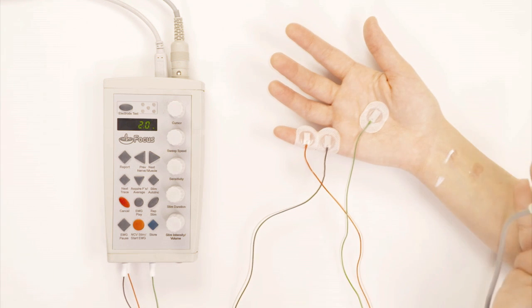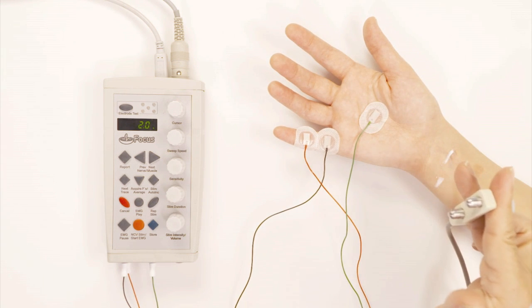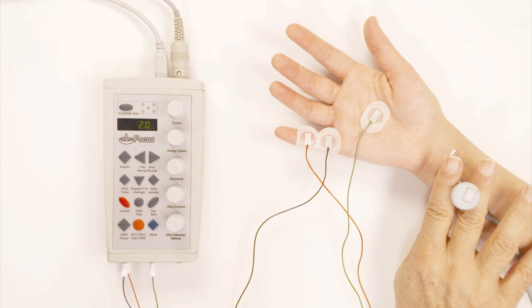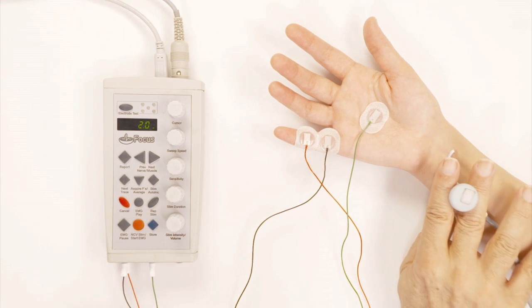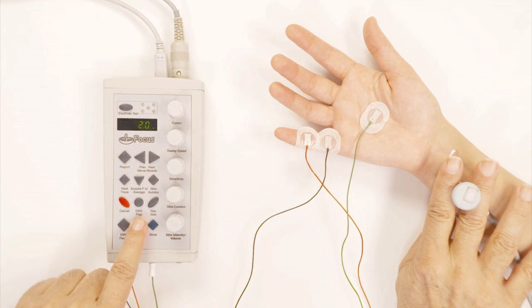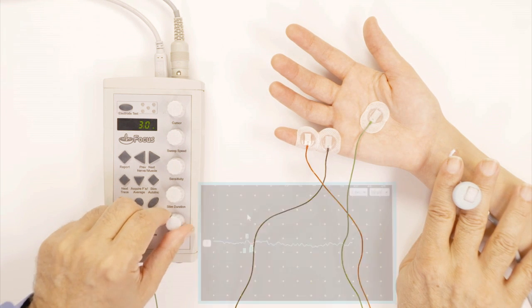I put some cream on the stimulator to make sure I have good electrical conductance. Then I put the electrode right here, that's where the ulnar nerve is at the wrist, and I'm going to begin stimulating. So I press on the orange button and I'm going to get a response here. Then I increase the intensity—I'm going to get more of a response, more of a response.